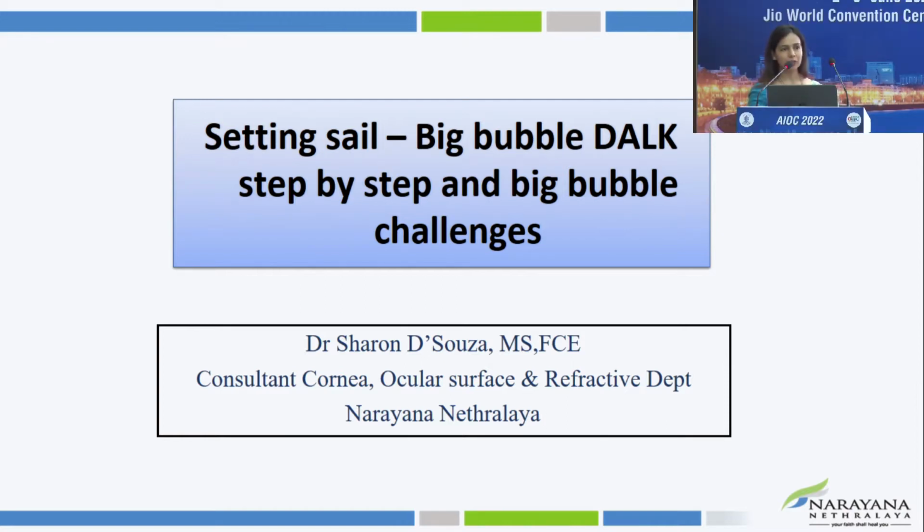So I'm going to run through a little bit of basic DALK and DALK steps, especially the big bubble DALK, and then we'll hand it over to our next masters who will take other steps.